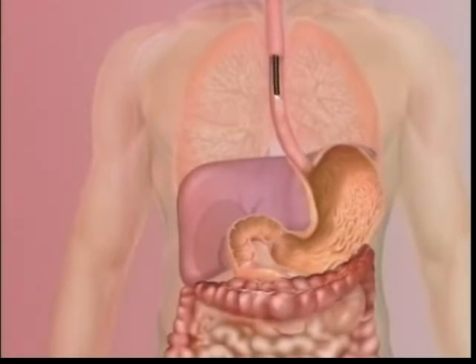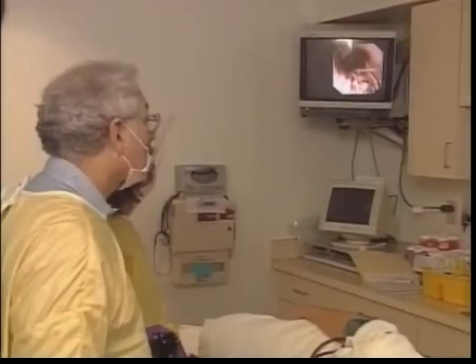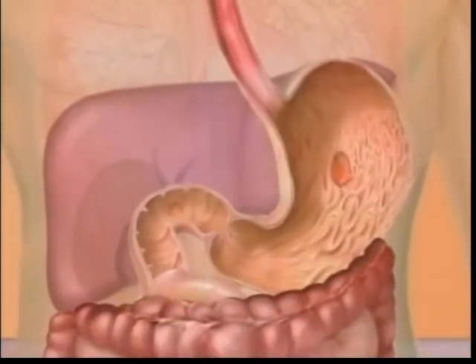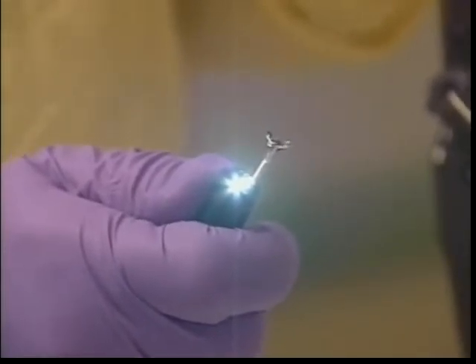Your doctor will use a long, thin tube called a video endoscope to see inside your upper digestive tract. Various controls allow your doctor to move the scope around curves, showing a complete picture of your upper digestive system. The endoscope has a tiny camera and light on one end that sends pictures back to a video screen. Your doctor will watch the video screen to look for inflammation, redness or irritation, ulcers, and bleeding. If your doctor sees any of these abnormalities, he can use tools passed through the end of the scope to repair damage or take tissue samples.